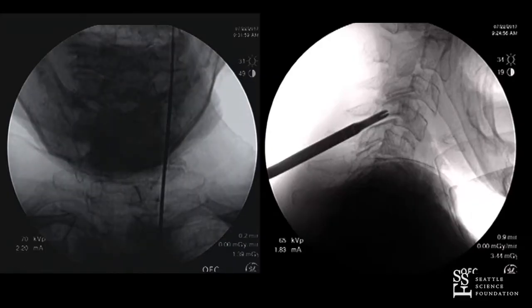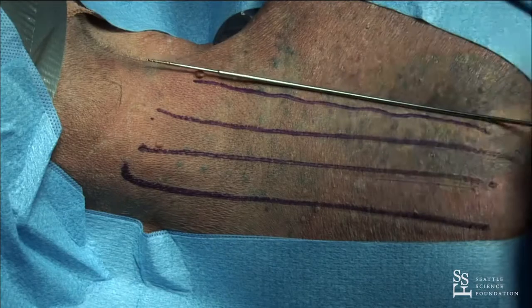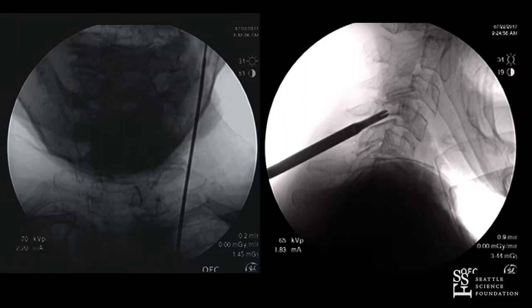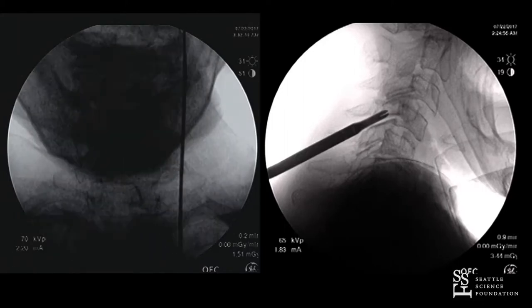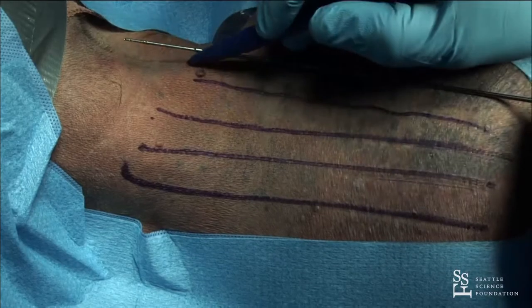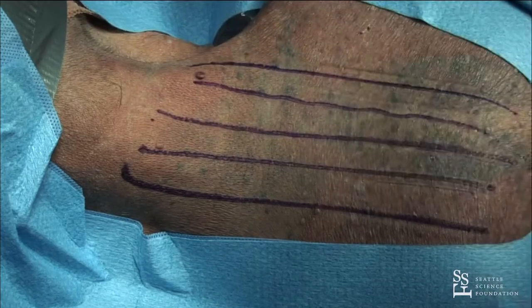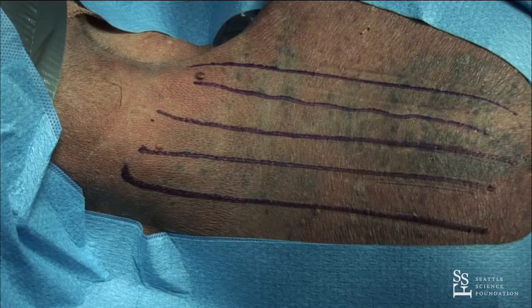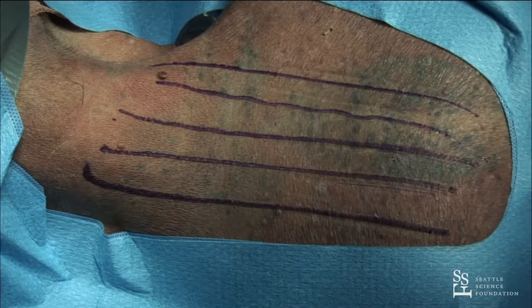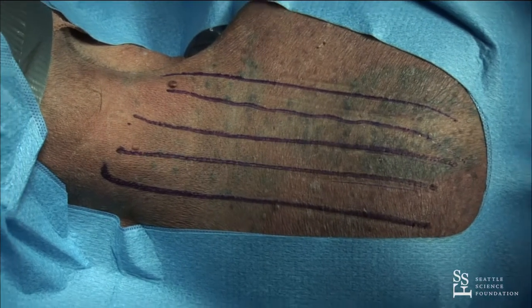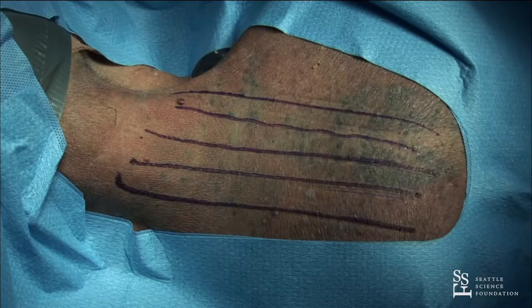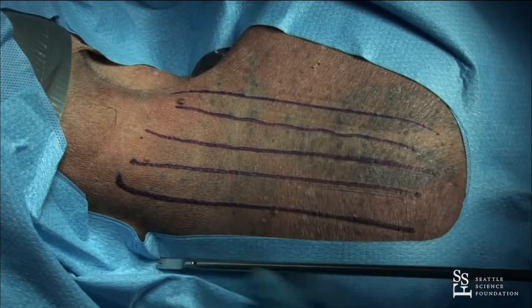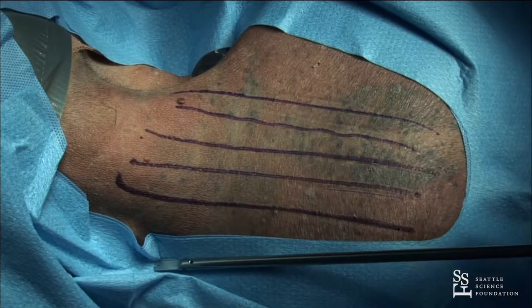So that's about the medial border of the facet on one side, and that's about the lateral border. So what I've done is marked the patient accordingly. To get an idea of where my incision is, I can place an instrument just outside to get kind of an up-down view of the trajectory and the facet — taking an instrument outside the patient's neck and taking a shot.